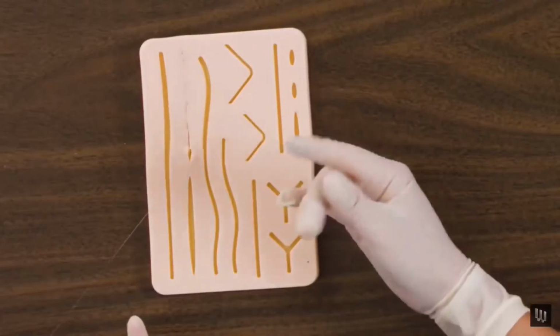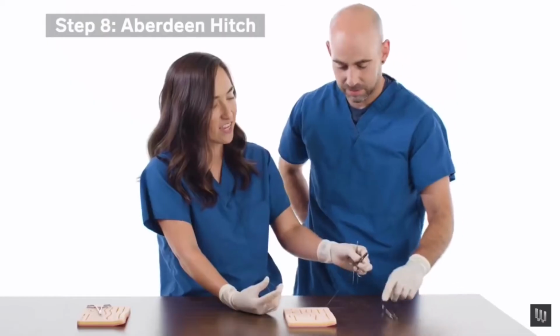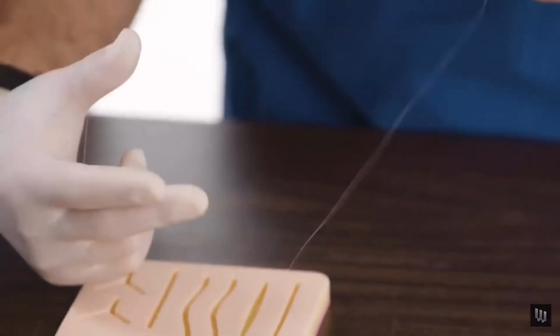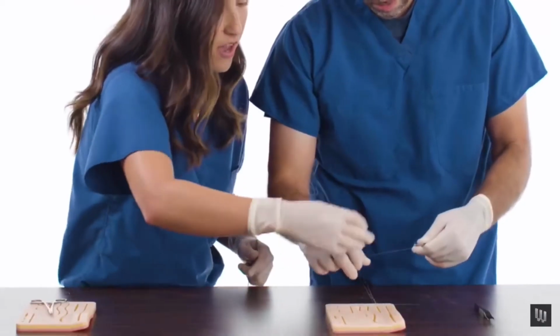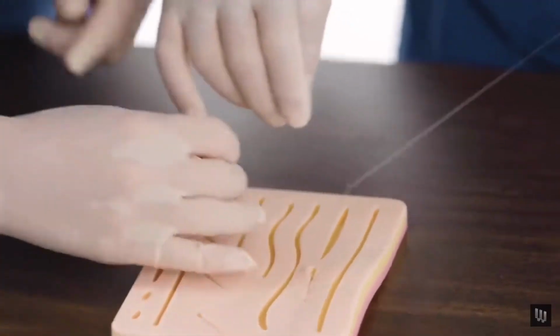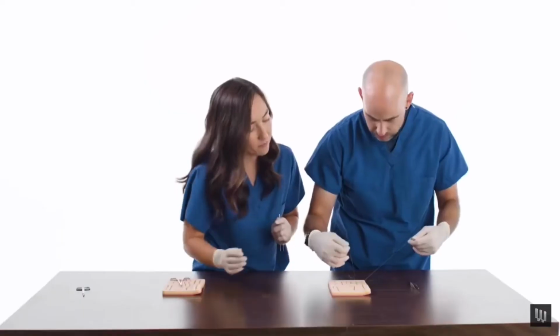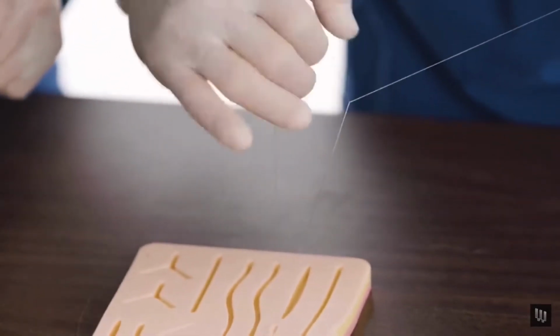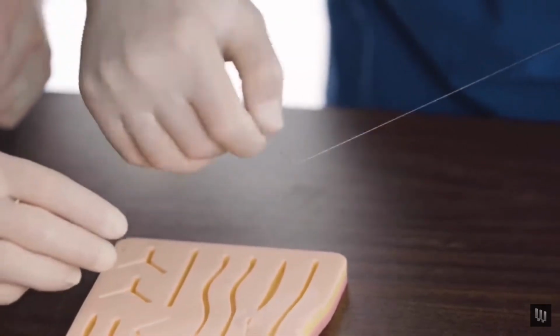You're going to close this with what's called an Aberdeen hitch. Okay, so take your post, again, we're protected here, and get your right hand through that loop. Then grab your post and bring it through your knot. Don't let your loop get too small. Okay, so I got one. Good, do another one. Keep tension on the post. Don't let the loop get too small. Pull on that, and that'll go down.